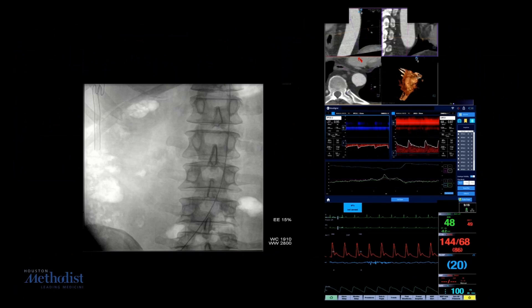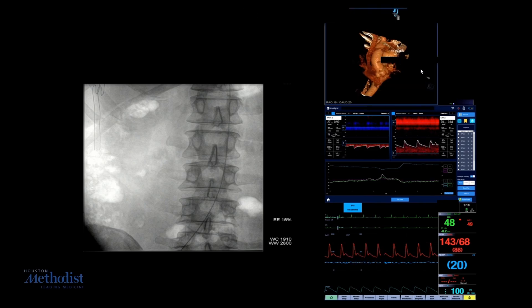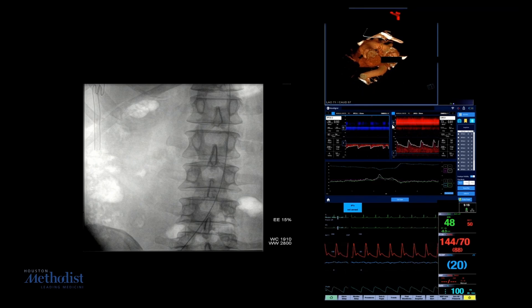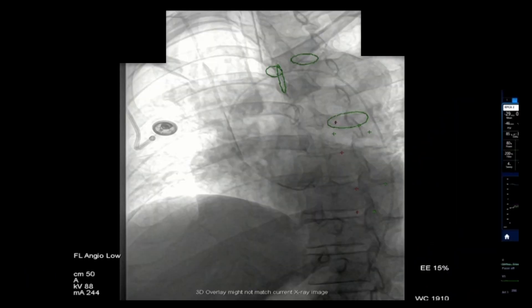At our institution, we use the quad setting on Kolster's IDA to record our cases. This setting allows us to record the fluoroscopy-guided angiography simultaneously with any imaging modality, such as the CT angiogram with contrast, the 3D reconstruction of the CT image, intravascular ultrasound or regular ultrasound, the transcranial Doppler or TCD screen, and vital functions. The image fusion markers on the fluoroscopy-guided angiography indicate the orifice of the left common carotid artery, the distal edge of the common carotid artery orifice, the left subclavian artery orifice, and the distal end of the aneurysm.